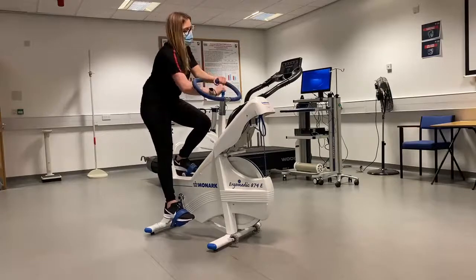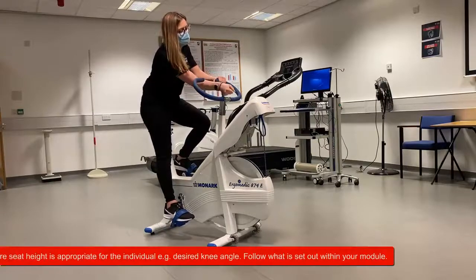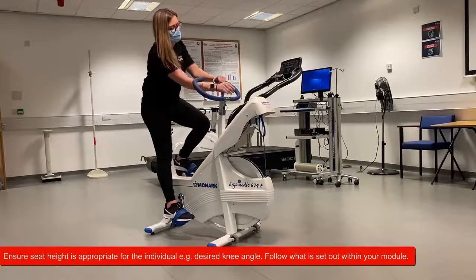Please ensure that you position the height of the seat in accordance with what is set out by your lecturer, for instance a desired knee angle.